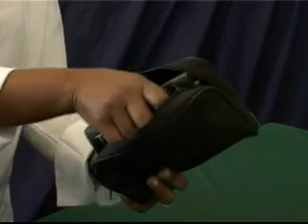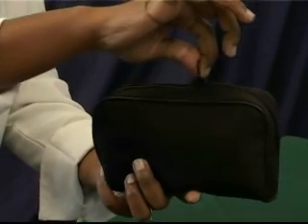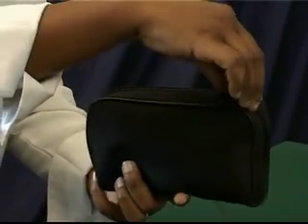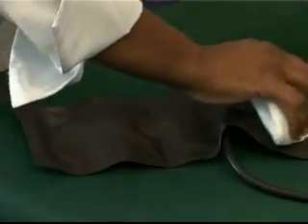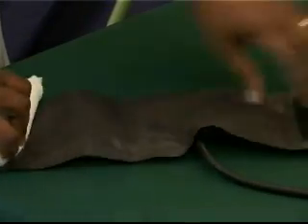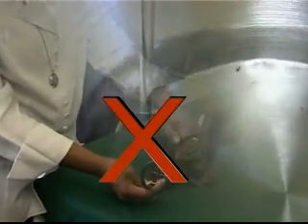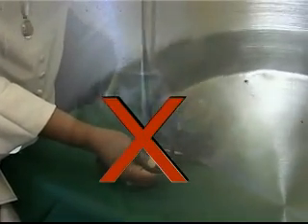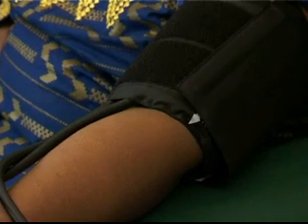Attempt to keep units free of dust and, where possible, keep the units in their cases. If this is not possible, cover the instrument with a linen cloth when not in use. Wipe the outer cover of the cuff with a damp cloth in the event of it becoming soiled with blood or medication. Do not immerse the cuff in water unless the tubing has been sealed off with a suitable spigot or clamp prior to washing. It is preferable not to use the blood pressure cuff as a tourniquet while taking blood samples unless provision is made to prevent blood spatter from soiling the cuff.